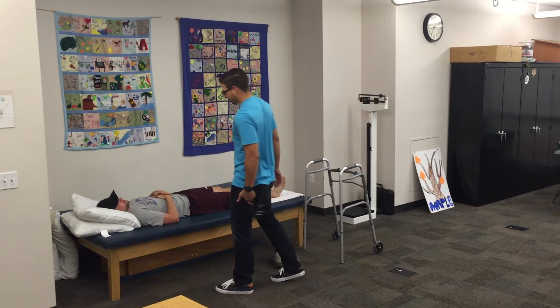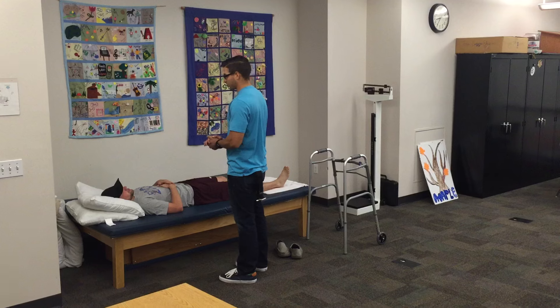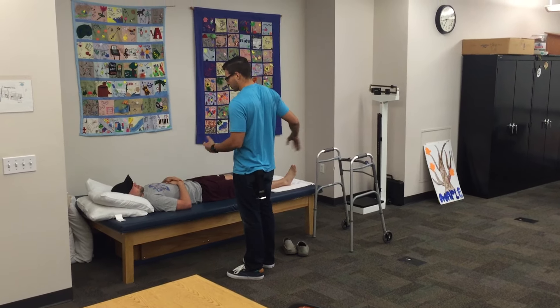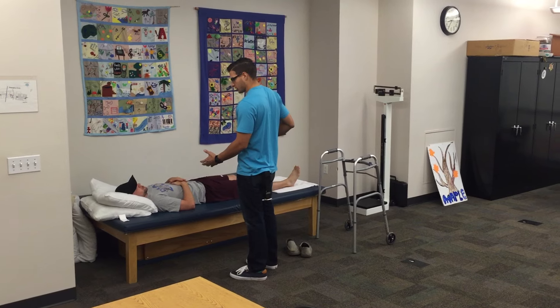How are we doing today, Kyle? I'm doing pretty good. Good. I'm Johnny. I'm going to be your student physical therapist. We're going to be getting up and doing a little bit of walking with the walker. Do you mind if I take you through that? Sounds good.